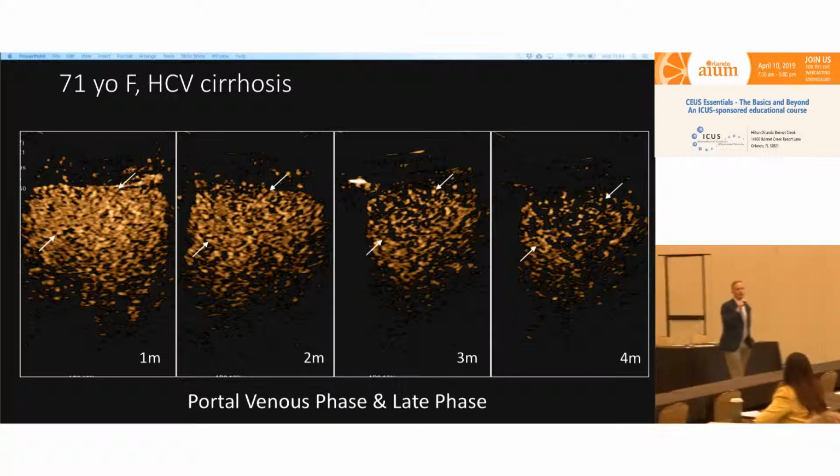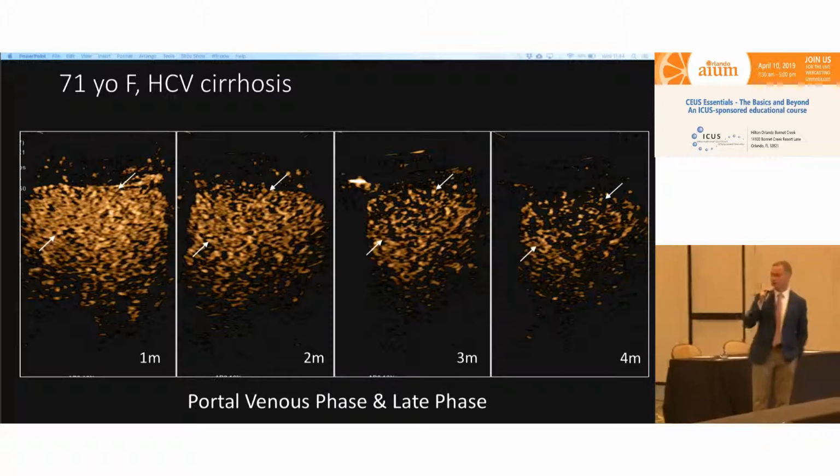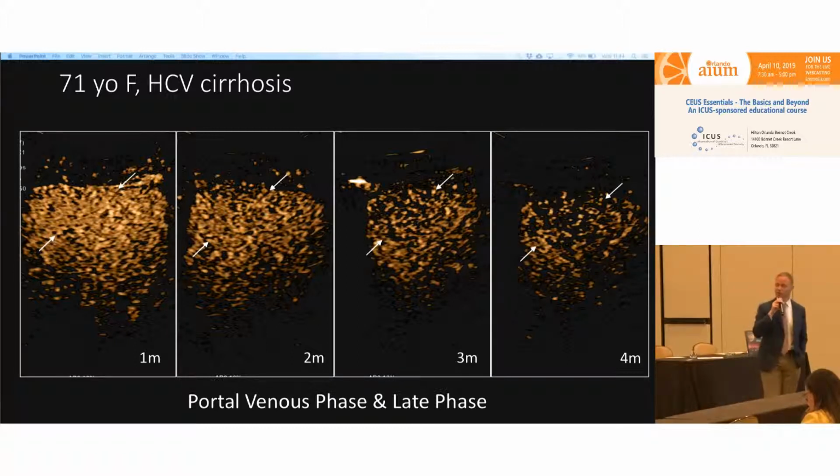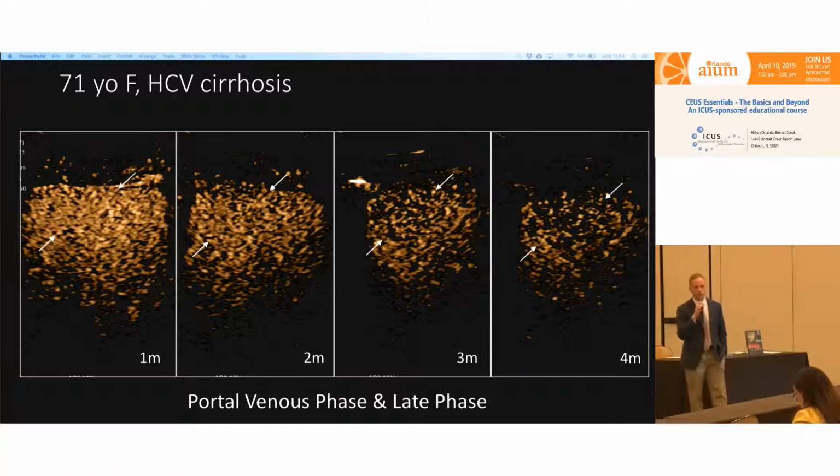So we just talked yesterday, and a couple of months ago I came up with a brilliant idea how to solve this problem. Turned out Stephanie had been doing this all along without telling anybody. If you have cirrhotic livers, the contrast degradation will be much higher compared to normal liver patients. Would you agree? Probably because the liver sinusoids are tighter, there may be increased pressure, maybe those bubbles go through too much to survive, who knows. But we do see significant degradation of contrast enhancement in the liver in cirrhotic patients.